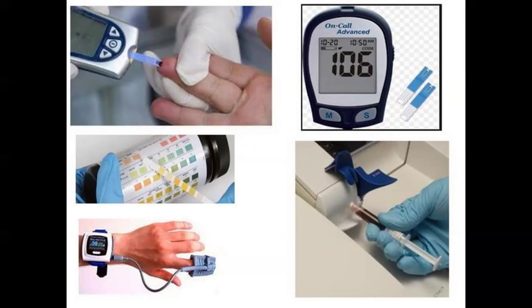It cost around 1,000 rupees and it gives a lot of information, especially about our saturated oxygen level, the SpO2 level. For a normal person, we need around 95% to 97%. When the oxygen level drops down, you can come to a conclusion that you have a problem with the lungs or the breathing or the respiration part. So this is a very good point of care device where you instantly get the oxygen concentration. Here in this example, you can see that the pulse oximeter is being connected to a smartwatch.